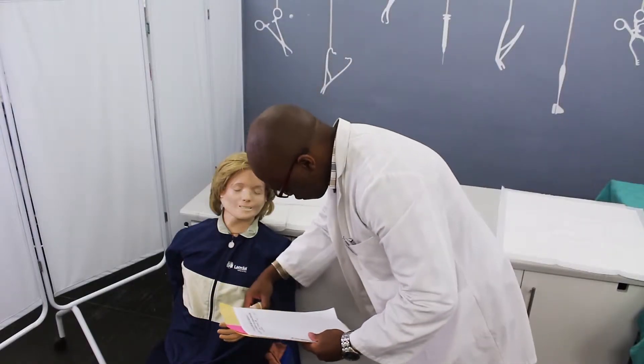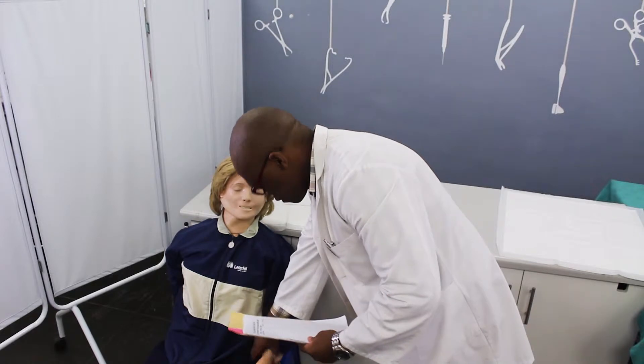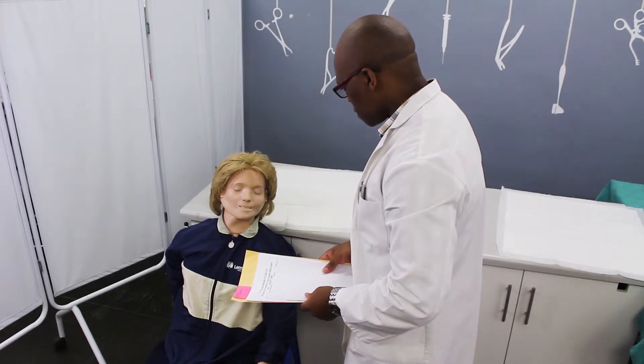Greet the patient and introduce yourself. Confirm the patient's identity by asking for his or her name and checking the armband. Explain the procedure and ask whether the patient has allergies or phobias. Obtain verbal consent from the patient to perform the procedure.